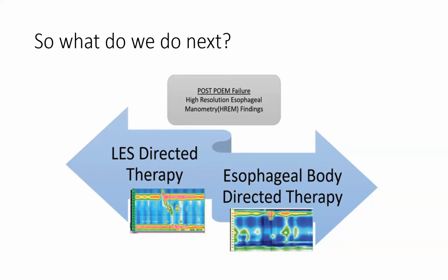Now, in places where EndoFLIP is available, and I think currently India has two centers, it's an expensive piece of equipment to use, around 79,000 as the cost of the catheter. If you can use that, it gives you a really nice idea. And I think internationally, EndoFLIP has been used a lot for redo cases. You can use it intraoperatively also for redo POEM or redo LHM, but the cost and the availability are a problem. Till the time it becomes cheaper and widely available, we have to rely on manometry.